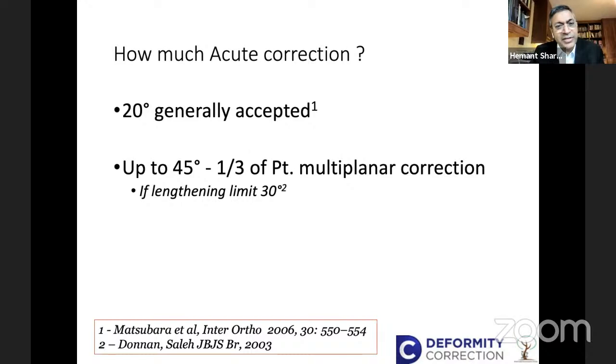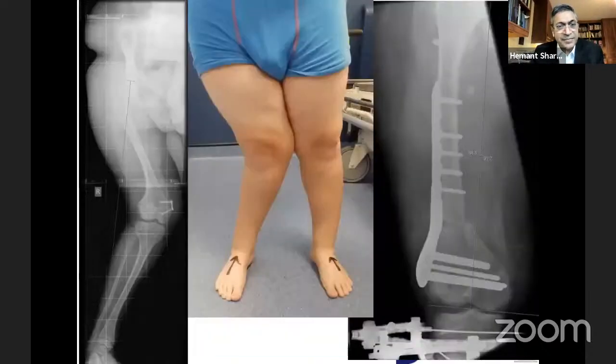Look at the patient, look at the scarring, and then plan it out and see what you can accept and what you can correct. This is an example of hypophosphatemic rickets. We were quite worried, so we did the release of the nerve. This is a fixator assisted correction, and we still use the frame because if there's any minor problems, we can always compensate in the tibia.